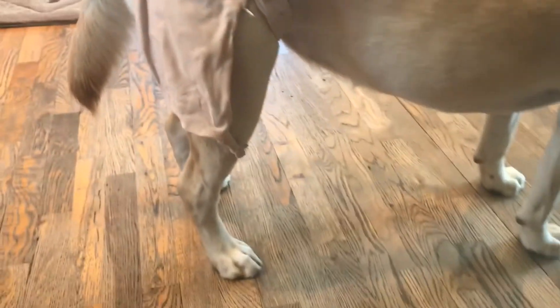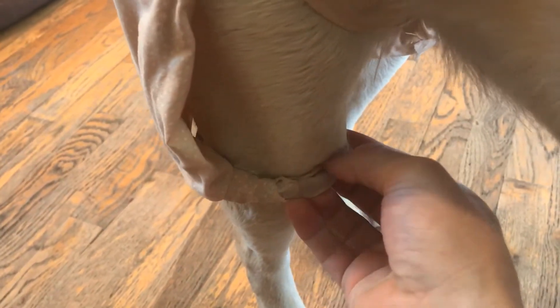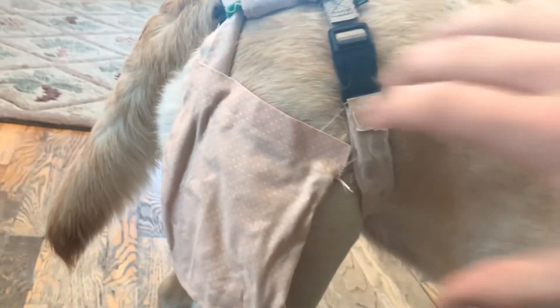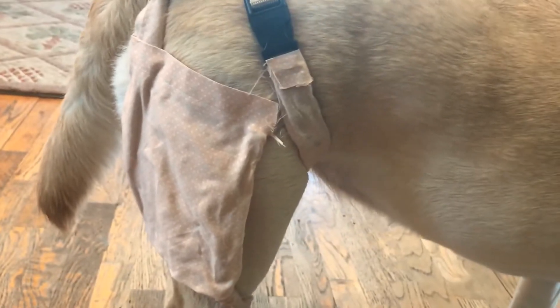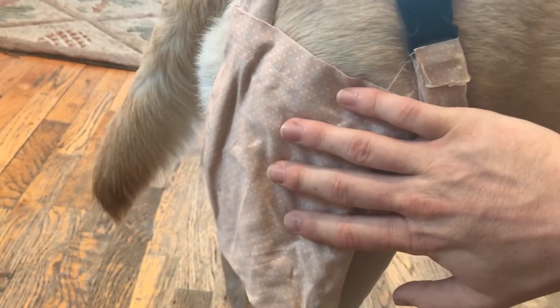Now, a few key parts of the design. First, both sides of the legs are adjustable, so it fits multiple dogs. See how it's completely open? That allows them to wear this constantly and not have to worry about it getting soiled. Another key part is this structural element that really gives support, kind of like an actual brace to a leg, giving literal support to the dog.